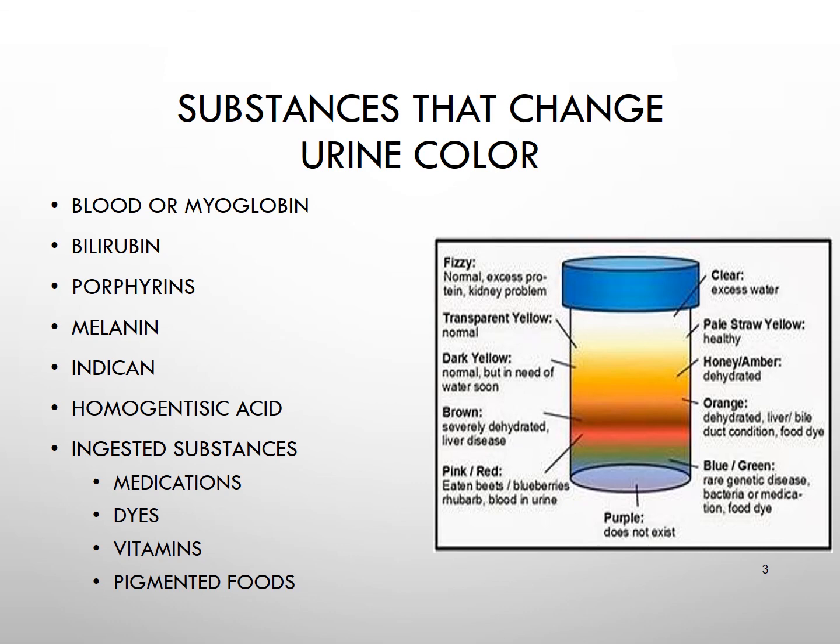A number of foods cause color changes in urine with no clinical significance. Now these are very highly pigmented foods such as beets, breath fresheners containing chlorophyll, and any kind of candy dye. Vitamins A and B can definitely produce an orange type of color, and beets definitely a red type of color. Now please refer to Table 5.1 for the urine color terms and the common causes that can cause these urines to turn a different color, as they will be on your next exam.